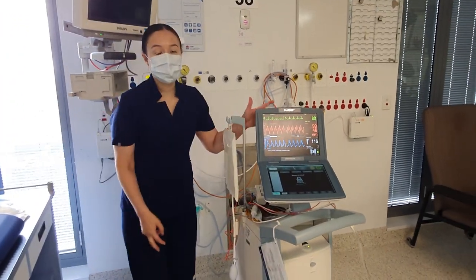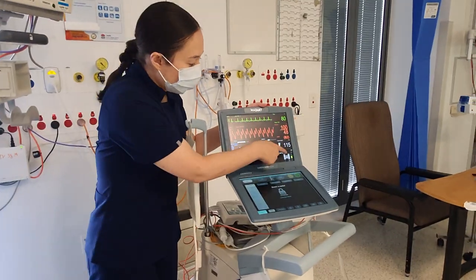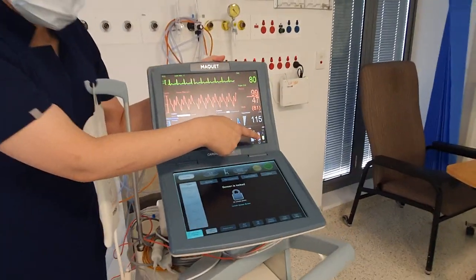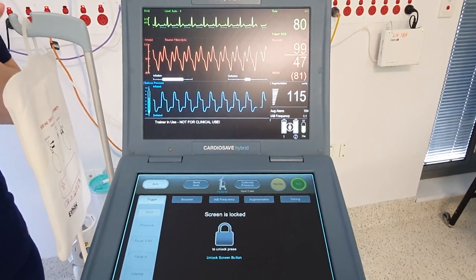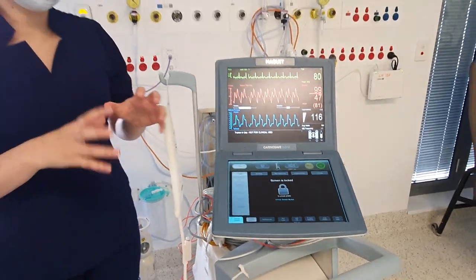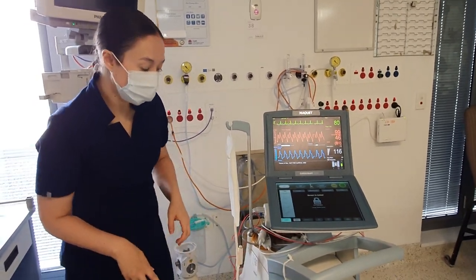Hi guys, I'm going to show you how to change the helium tank on the Cardiosave. The little icon for the helium tank is just here. Don't worry — the balloon pump won't stop working when you change the helium tank. It'll have enough helium and give you enough time to be able to change the helium tank.